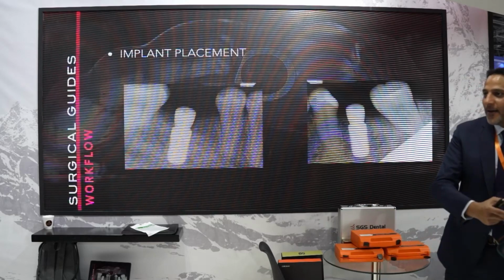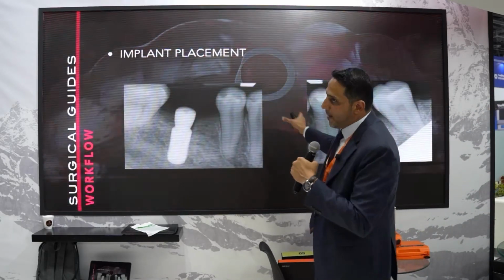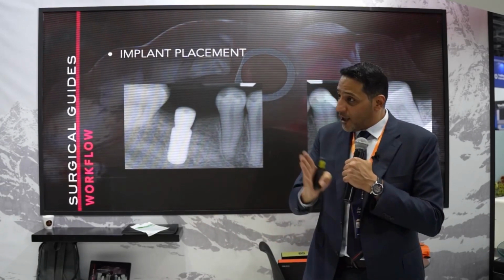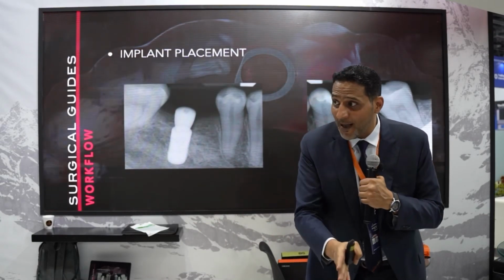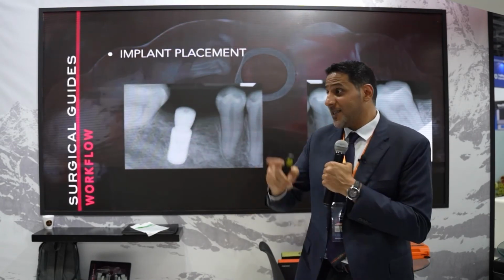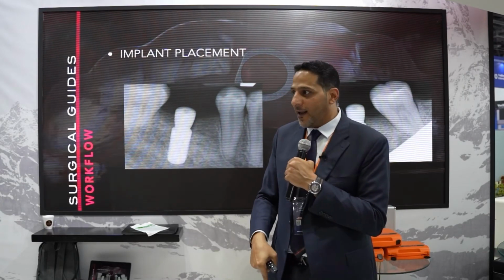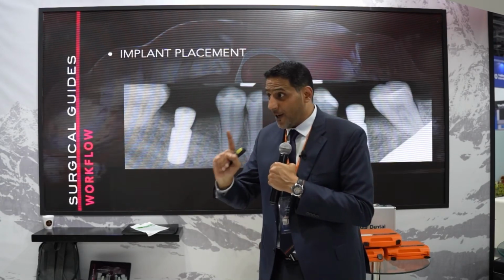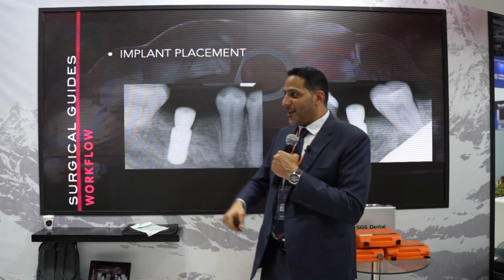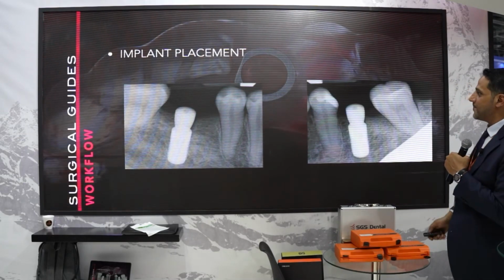We can use them, but the most important thing, like the one from Nobel Biocare, it gives you the full guided protocol for the Nobel implant, but for the other systems it only gives you the initial drilling, not the fully guided. So this is the advantage of the open system. Okay?